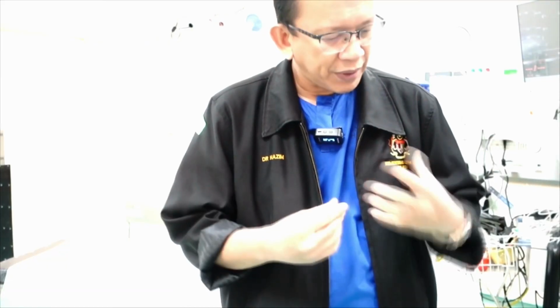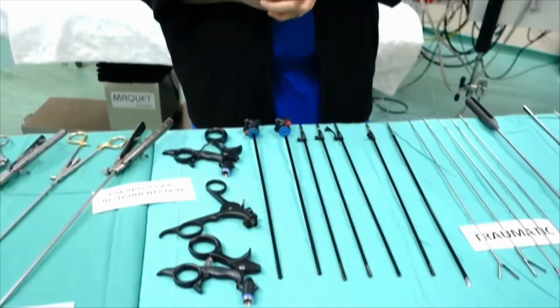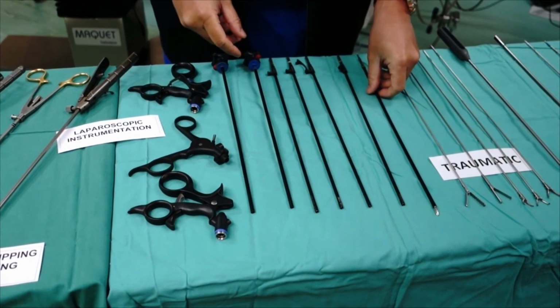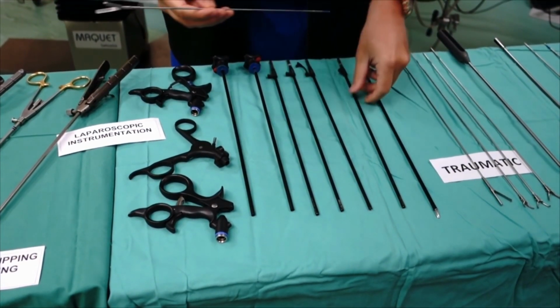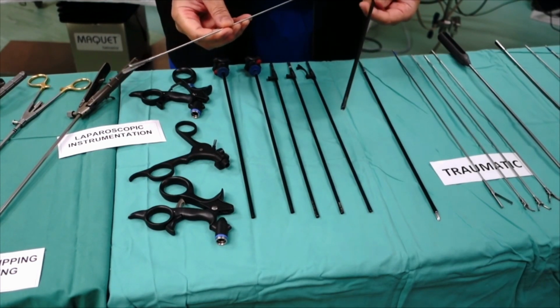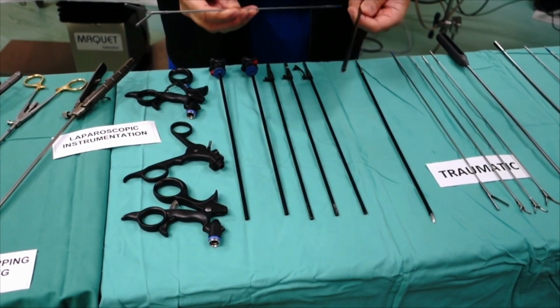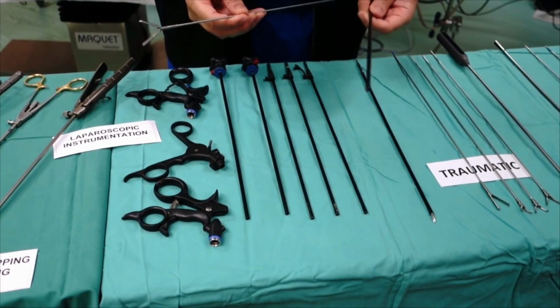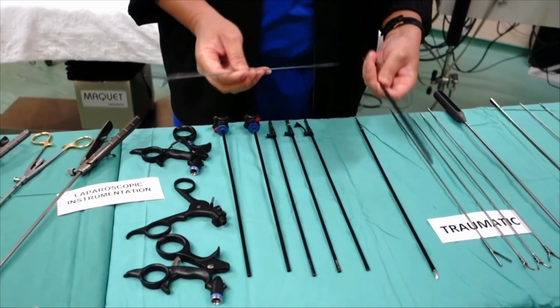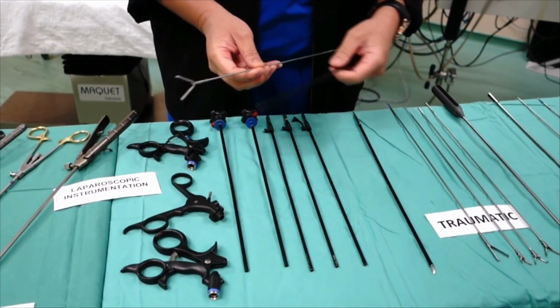Now, if the patient can afford it, it is better to use disposable instruments, because with instruments like this, it is quite, I would say, not possible to always clean thoroughly. You have been using these reusable instruments because there are limited monetary funds to buy all of this, right? But if you have the money or the patient is willing to pay, it is good to get a disposable instrument.